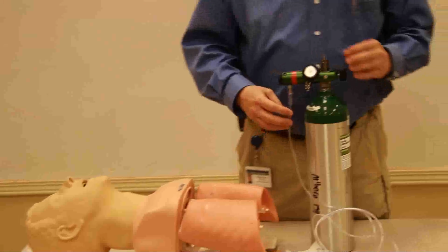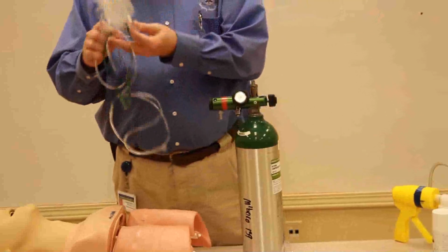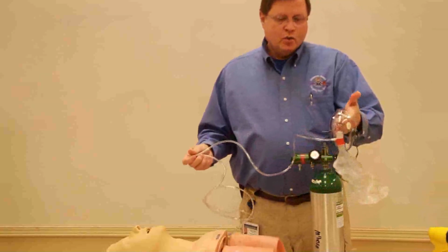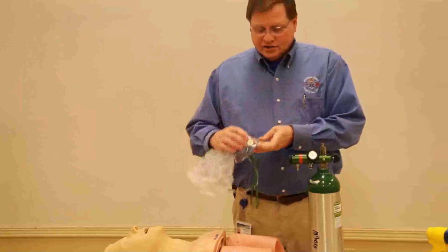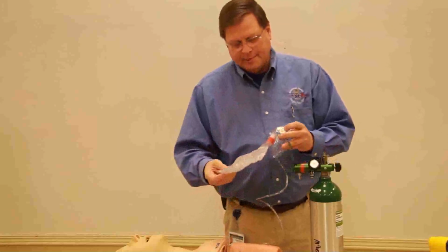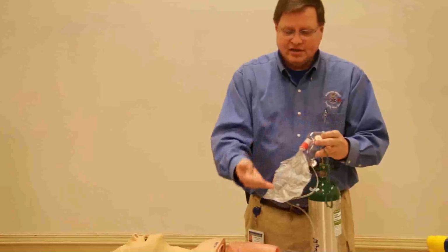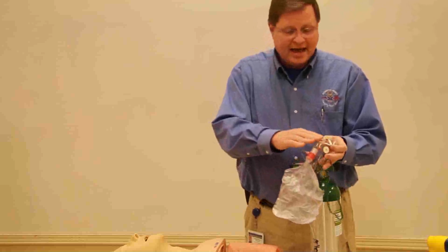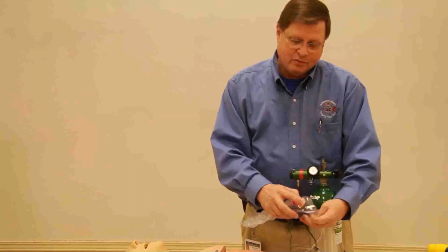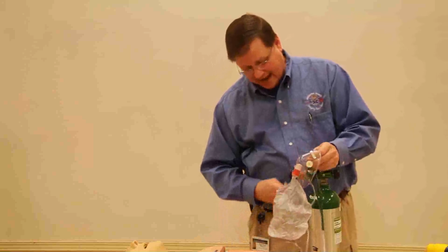Now, higher concentrations of oxygen, as in trauma patients and as in patients who are having a myocardial infarction or whatever the case may be, hypoxic patients, where you want high concentrations of oxygen, we use a non-rebreather mask. A non-rebreather mask has a one-way valve here, and it also has a one-way valve inside of the mask. So oxygen can only go from here. Now, the key is to fill this reservoir up with oxygen so that when the patient breathes in, the oxygen actually comes from the reservoir bag into the patient's mask. Now, in this particular mask, we get near 100% because we have a one-way valve here, but this is open. It's never 100%, okay?